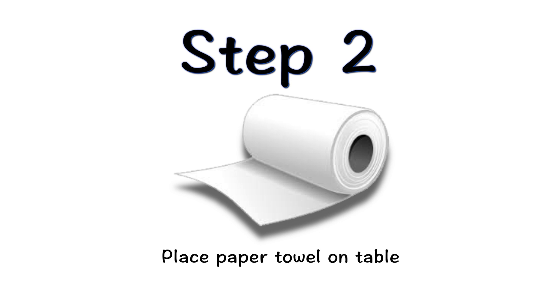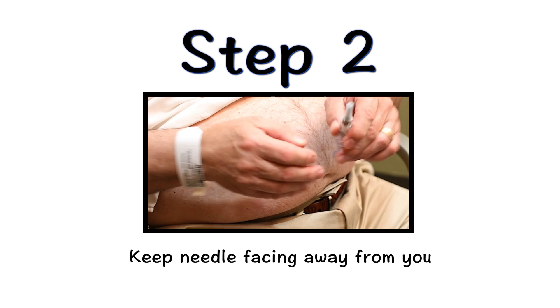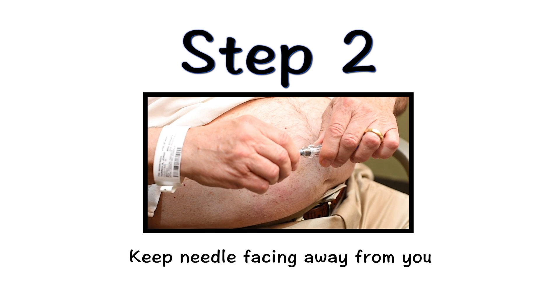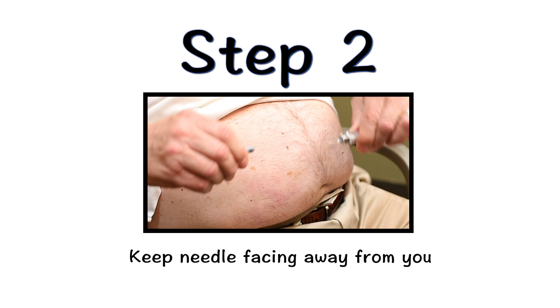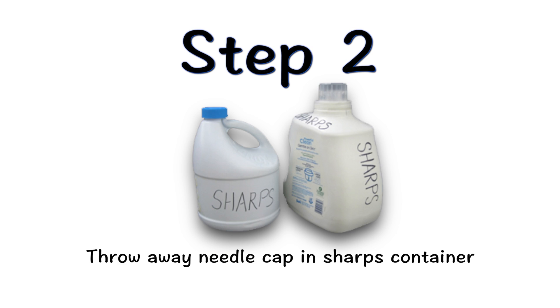Place a piece of paper towel on the table. With the needle facing away from you, hold the syringe firmly in one hand and pull the needle cap straight off, extending your hand away from the needle. Do not recap the needle now or after the injection. Throw away the needle cap in a sharps container.